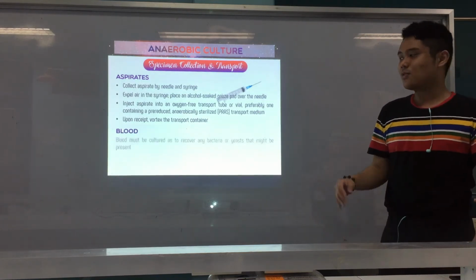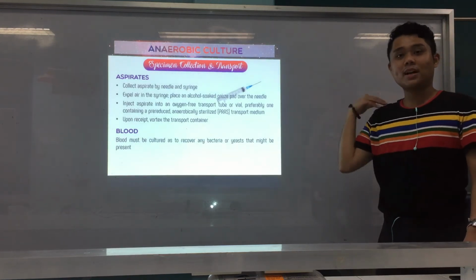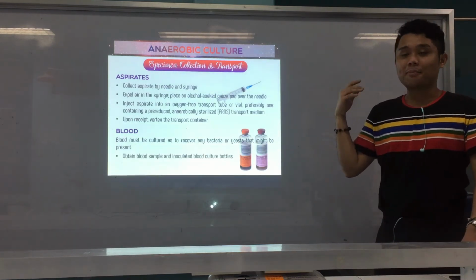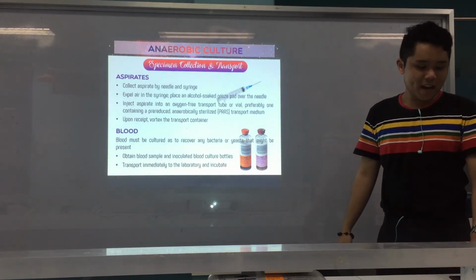Okay, next is blood, of course. Blood must be cultured. Still the same sa atong blood culture na topic, alright? Obtain blood sample, blood culture bottles, and transport immediately to lab and incubate.